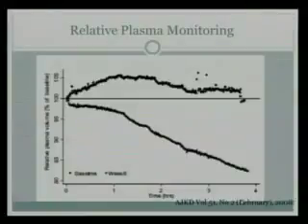So this is the relative plasma volume percentage. It's looking at the absolute hematocrit, just like if somebody is hemoconcentrated when they're volume depleted. It's the same sort of concept, but you're monitoring it in real time to try to get an idea. If that number isn't changing too much, then the patient may be volume overloaded.